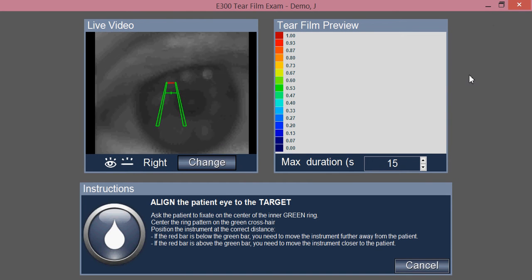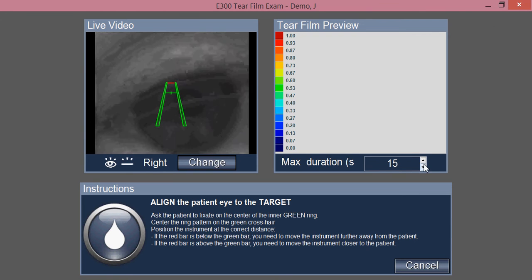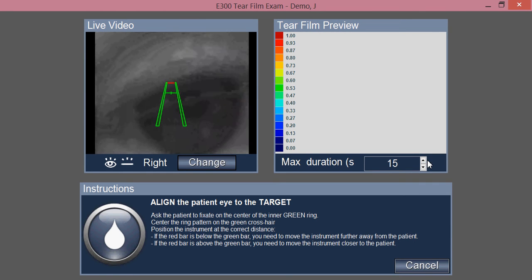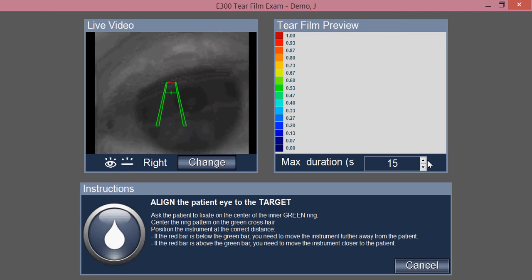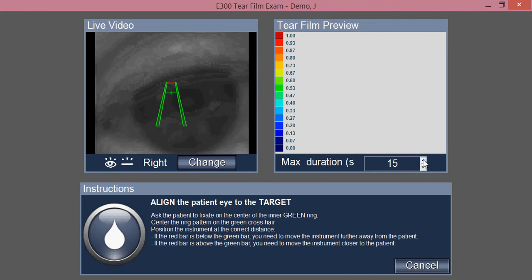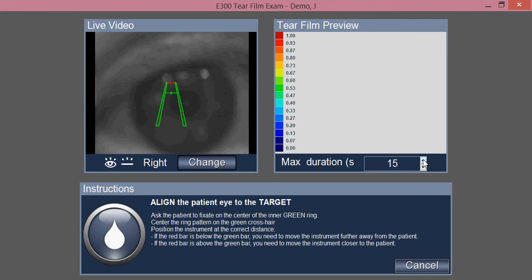With the capture window open, select the duration and time you would like to capture the tear film over. In this case, the default duration is 15 seconds.